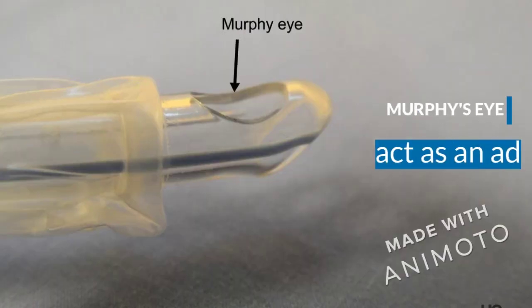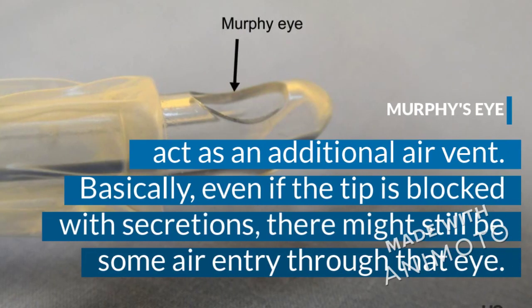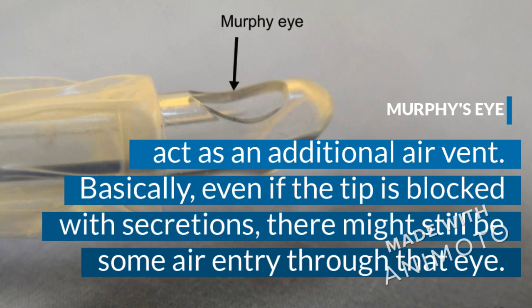The next part is the Murphy's eye. It is present at the tip of the ET tube. It acts as an additional air vent. Basically, if the tip of the ET tube is blocked with secretions, there might still be some air entry through that Murphy eye.